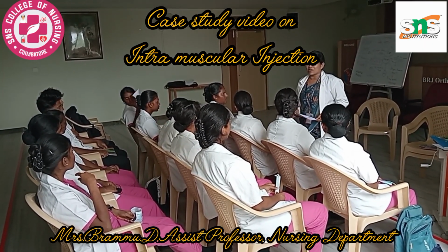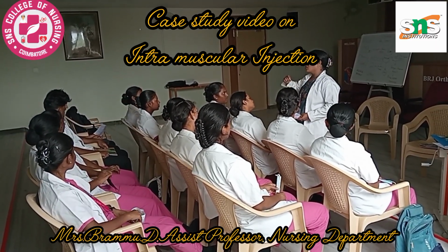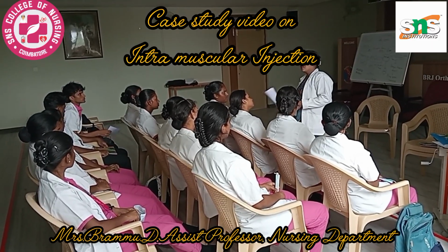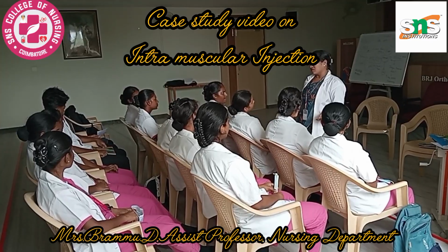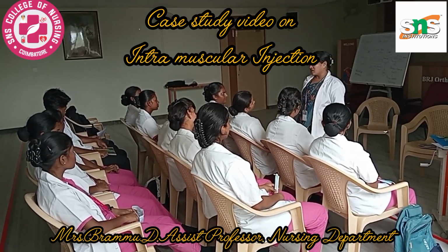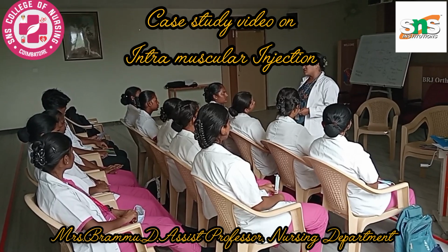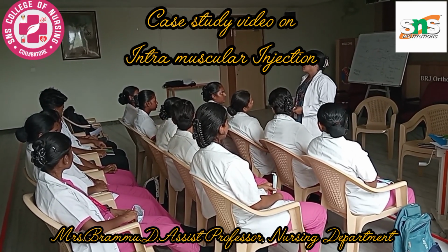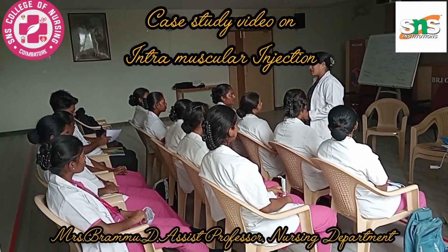If there is no blood, you are only getting air out of it, then slowly you can inject the medication, talking to the patient and diverting the patient. You can ask, which dress, if there was a new festival did they celebrate, did you buy any dress, what is your favorite movie. If you speak like that to the patient while giving the medicine, they will divert themselves. Remove the needle and massage that particular site.